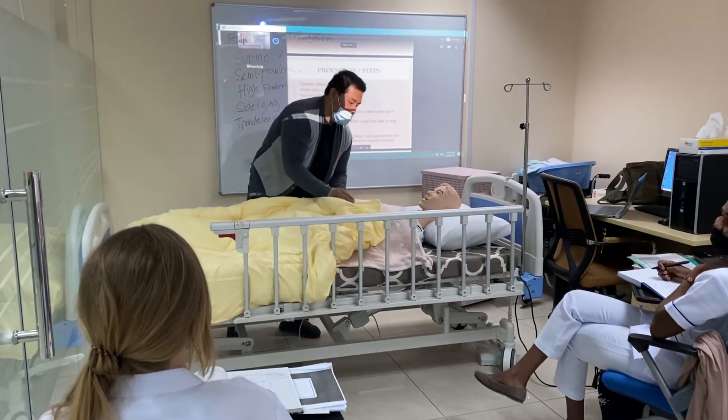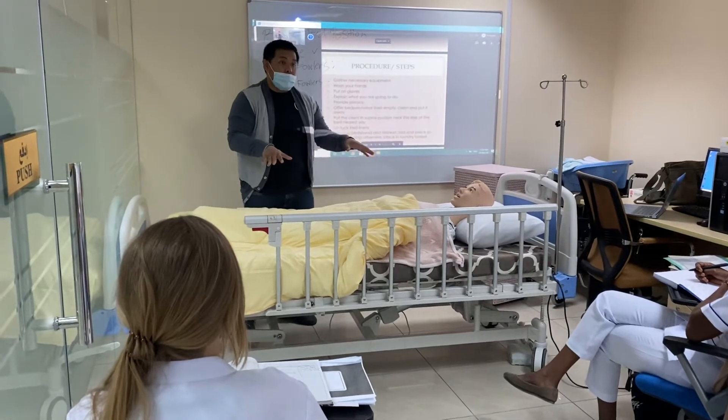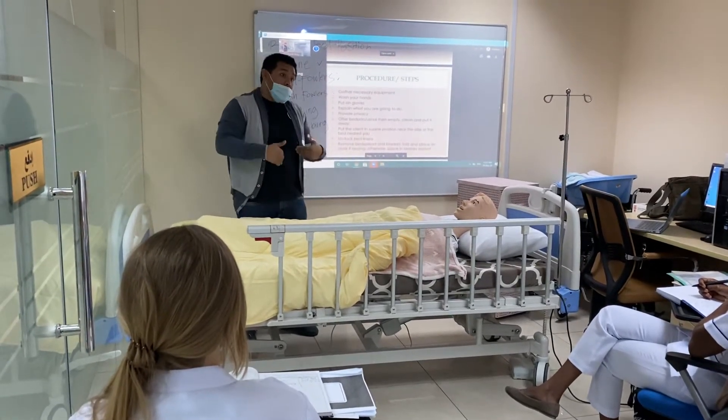When putting the client in side-lying position, the first thing you have to do is put the bed in a flat position, then open the side rail on your side.